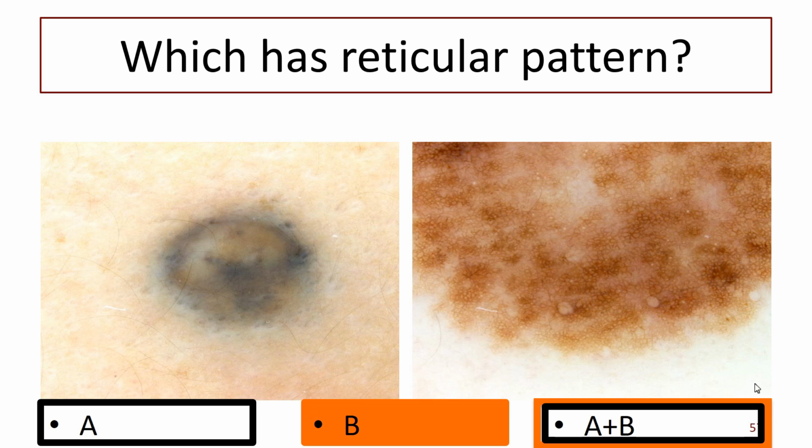Yes, it's true. But what structure is it? No, a circle is a line joined up. Can you see a line joined up? It's a round lesion, but the structures... So, in fact, you can't see any structures here. We're not seeing any lines, and we're not seeing any dots or clods. We're just seeing irregularly distributed pigment, which actually makes it a single pattern.